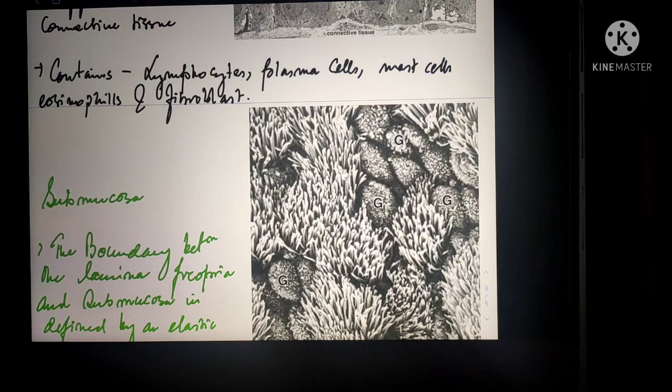The submucosa contains mucous glands with serous demilunes. Their ducts consist of a simple cuboidal epithelium that extends through the lamina propria to deliver their products to the epithelial surface. These glands are particularly numerous in the cartilage-free gap on the posterior portion of the trachea. The submucosal layer ends where its fibers blend with the perichondrium of the cartilage layer.